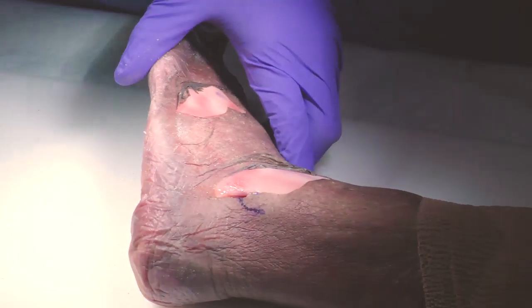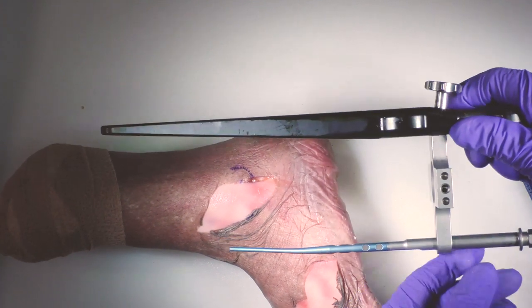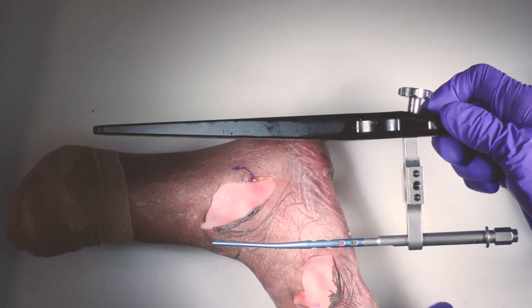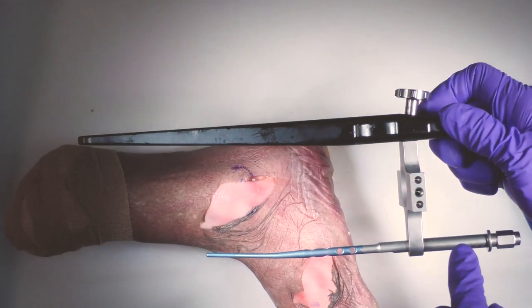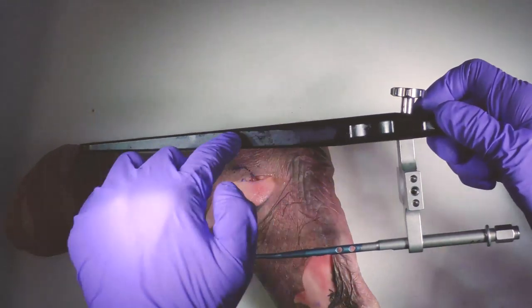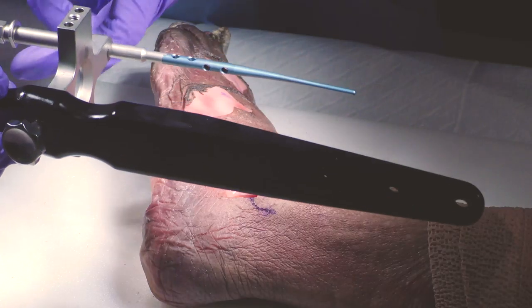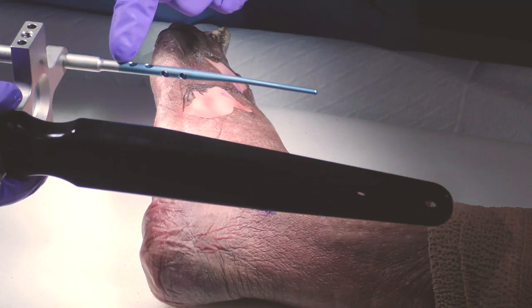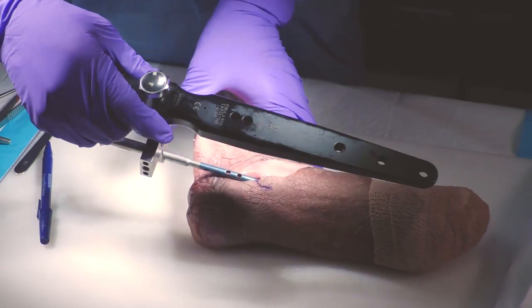In this case we're going to use this small one. You can see the way it is set — it has the nail, attached to an AP guide for the distal locking screws, and this long guide is going to be for the proximal locking screws. Now I'll turn it around to show the way it is going to be positioned. You can see that the nail has a small curvature that goes with the anatomical shape of the fibula.